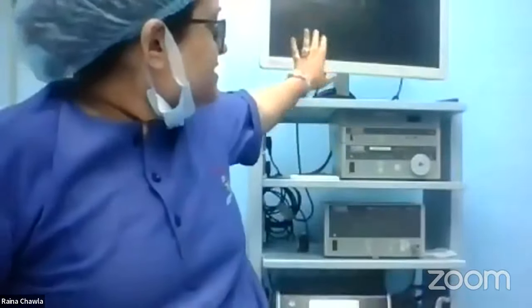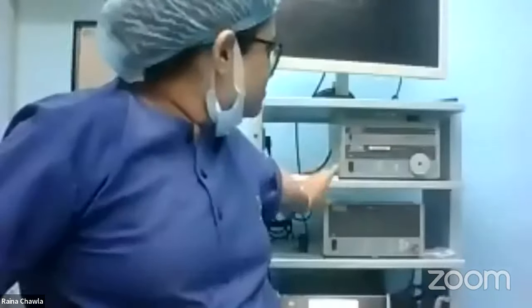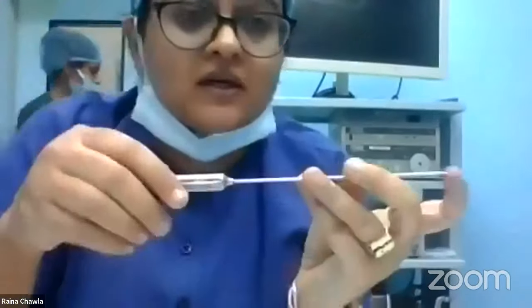We have an image system, we have a camera system, we have a light source, and we have insufflators. Okay, we have a Veress needle through which we create pneumoperitoneum, and we usually create an infraumbilical or supraumbilical incision. If the patient has had multiple previous surgeries, you may anticipate adhesions. So we can also create pneumoperitoneum through another point, which is the point in the left upper abdomen.